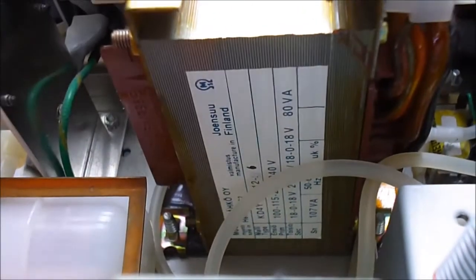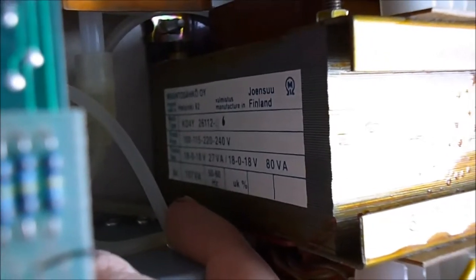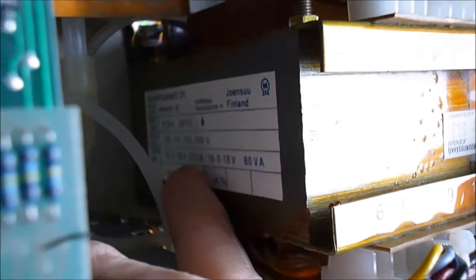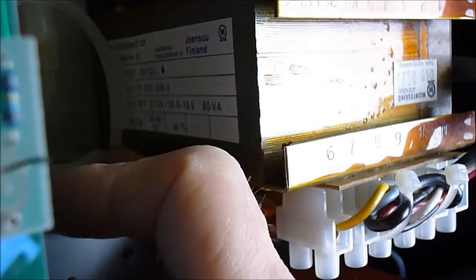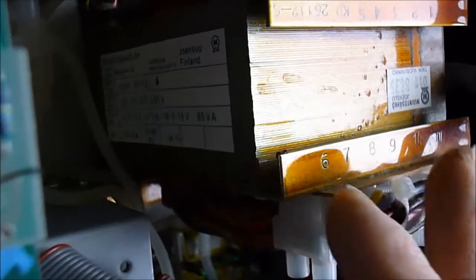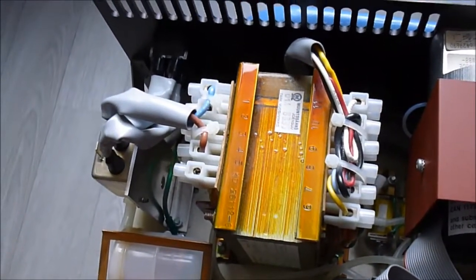You can see a very, very big transformer here. Made in Finland. In fact, it could be reused quite easily because you can see the voltage is 18V center point, two times, one 27VA, one 80VA. So it is on the universal input also. So it is very nice for a custom homemade audio amplifier or something like this, I think.